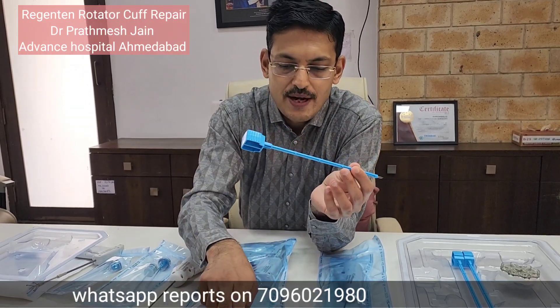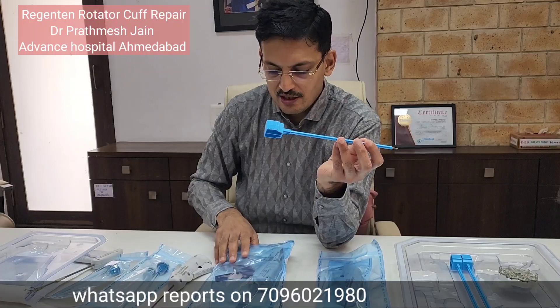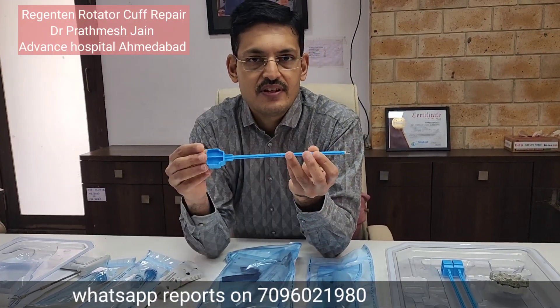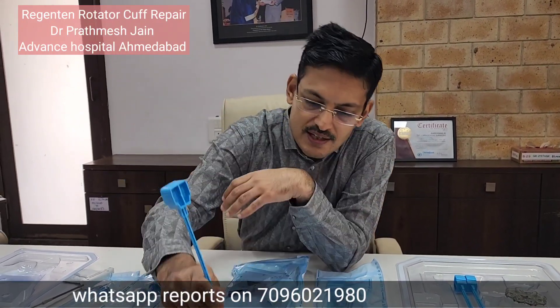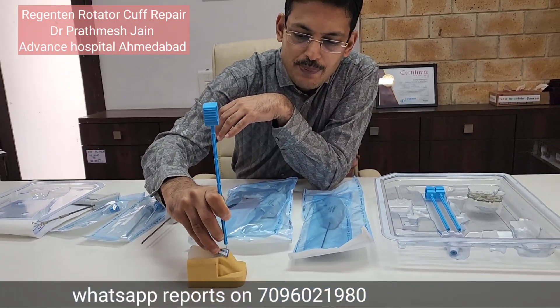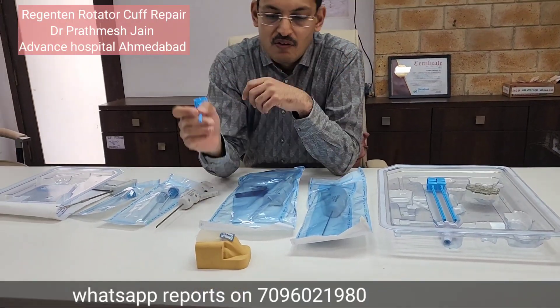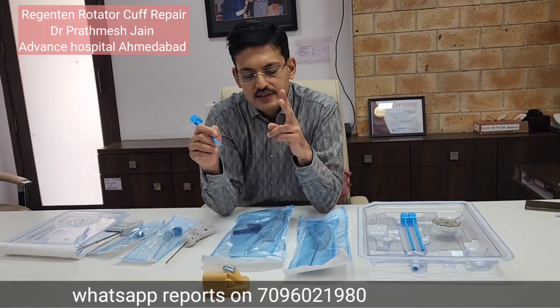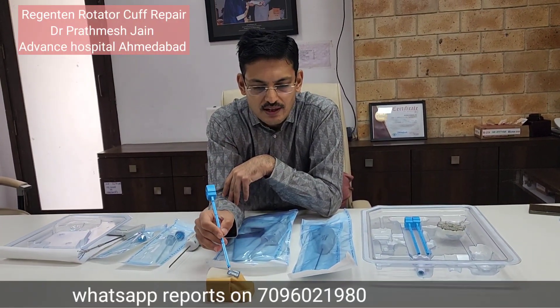Once the tendon anchors are fired, you use the bone anchors. As compared to the tendon anchors, these are PEEK anchors — not bio-absorbable. They are also provided with a gun. These PEEK bone anchors are hammered into place and fit very nicely into the hole, securing the patch firmly over the repaired area.